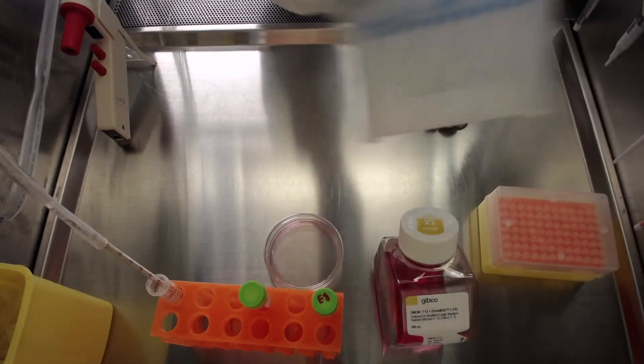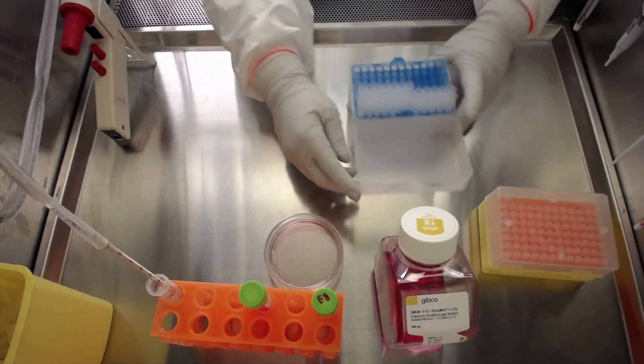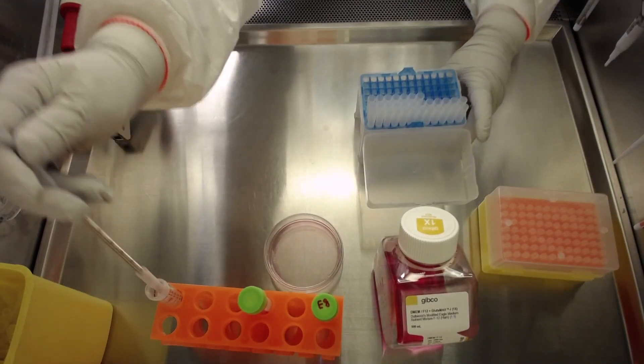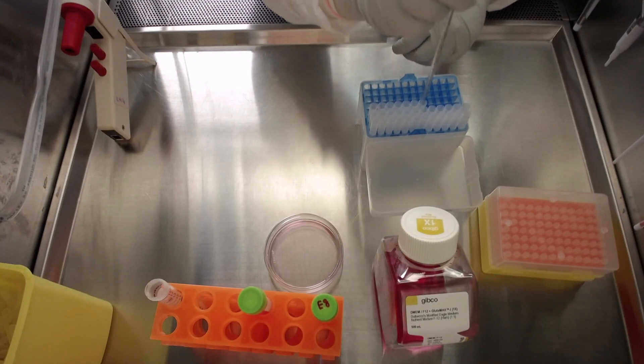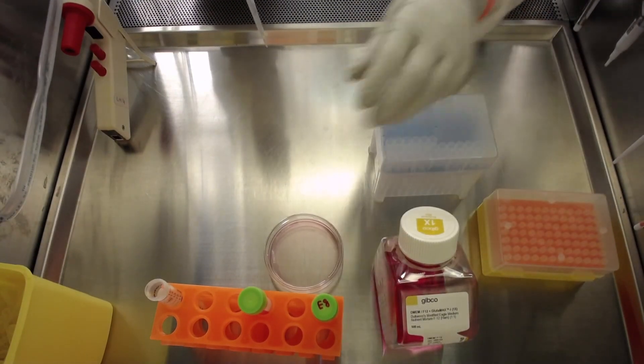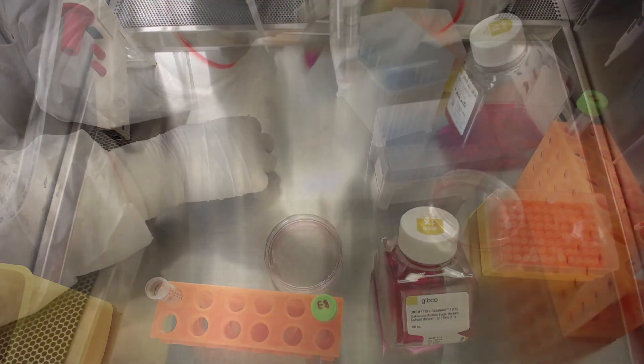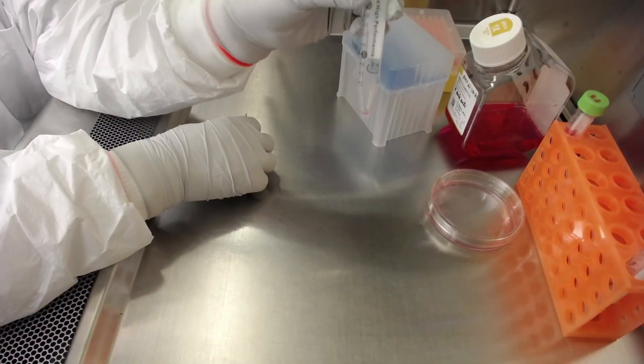Long exposure of cells to dimethyl sulfoxide can lead to cell death. To avoid it, remove as much as possible of the supernatant containing dimethyl sulfoxide by using vacuum aspiration. Make sure to not disturb the cell pellet. The cell pellet should still be visible at the bottom of the tube as shown.